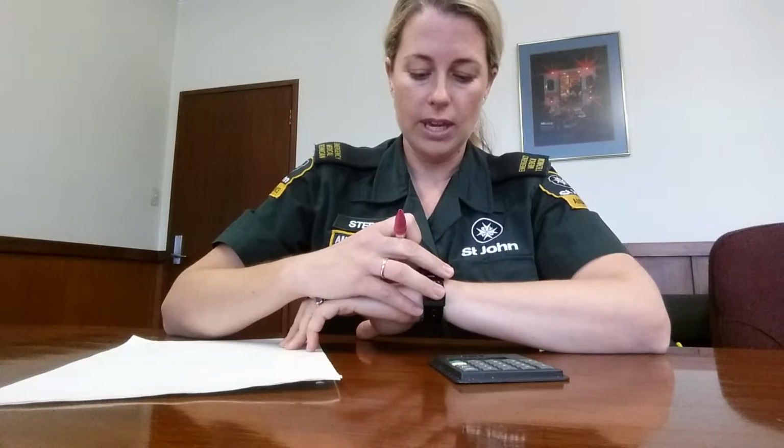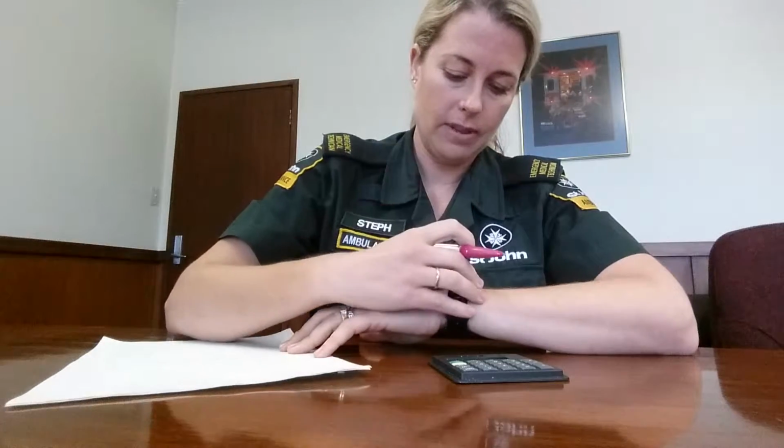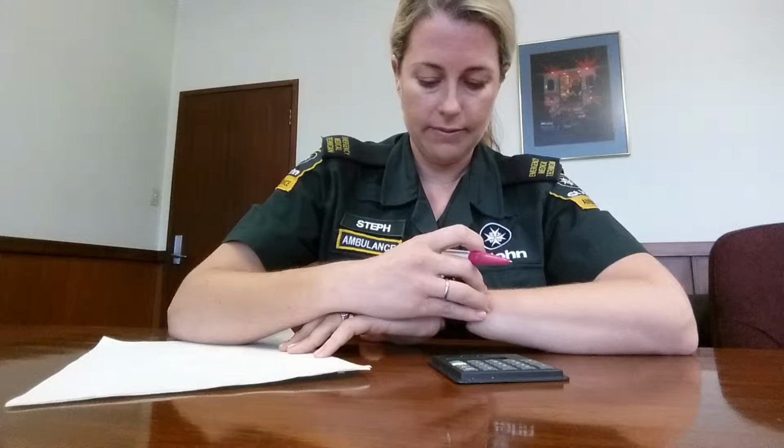Okay, so we have Stephanie Oliver doing her 12-lead ECG assessment. Student number is 15917495. You've got a minute to take notes on your steps if you want to. Okay. Yeah. A minute. We'll start. Okay.